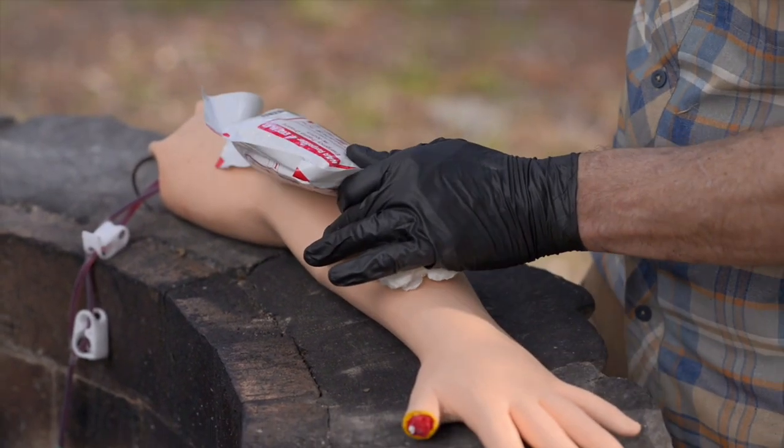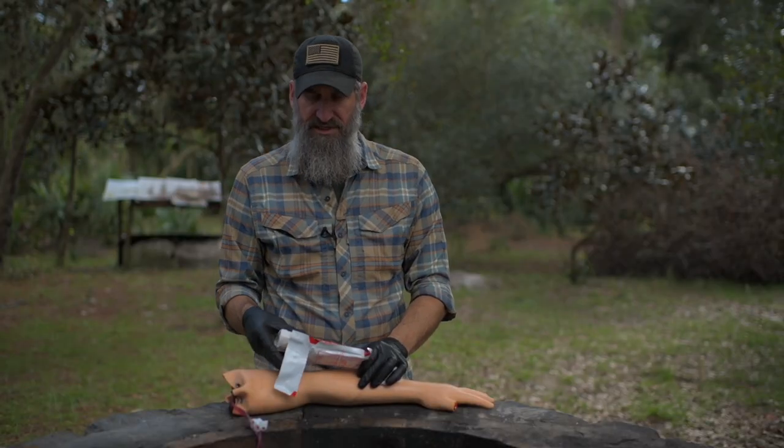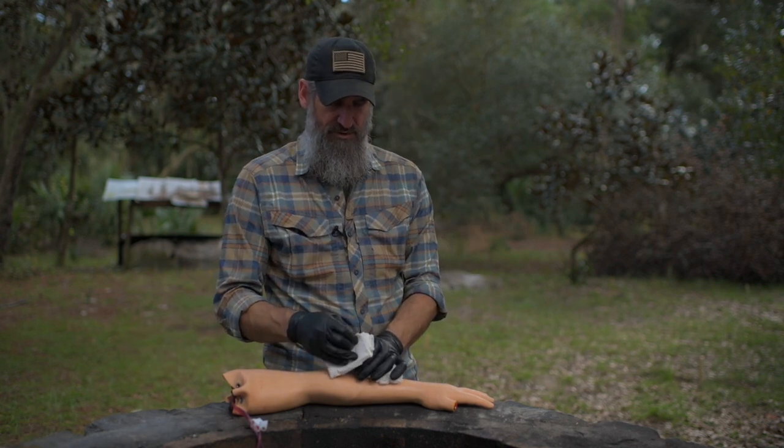I don't have an Israeli to use on this one, so I'm going to use an emergency trauma dressing, which is essentially an Israeli dressing that has been simplified. All right, it's still very similar, but it doesn't have the pressure bar in place. So, very similar look when you pull it out.